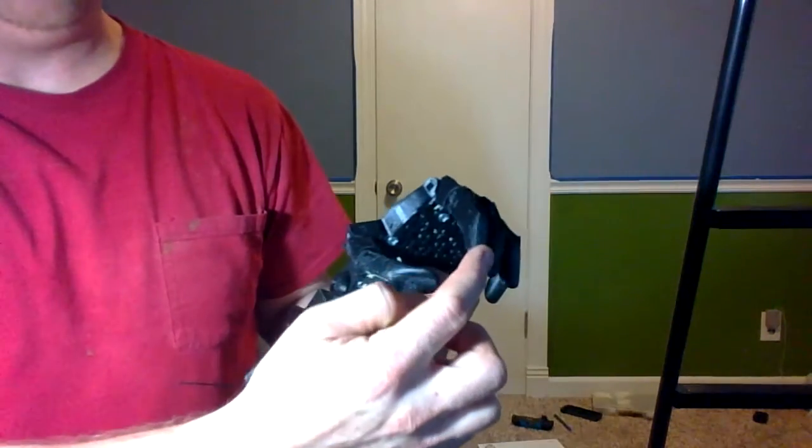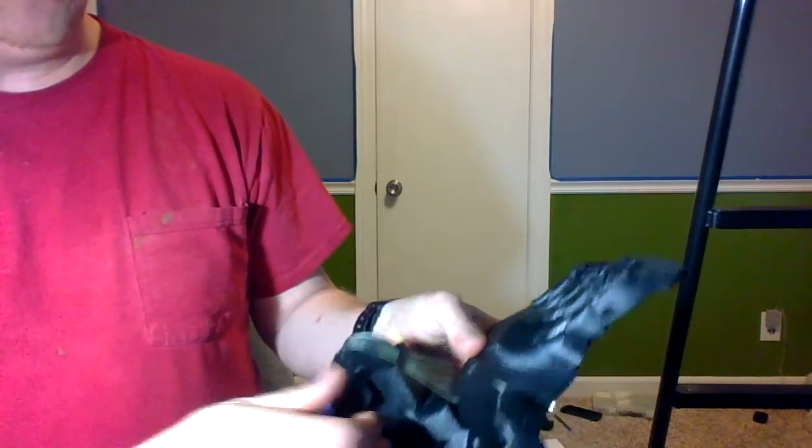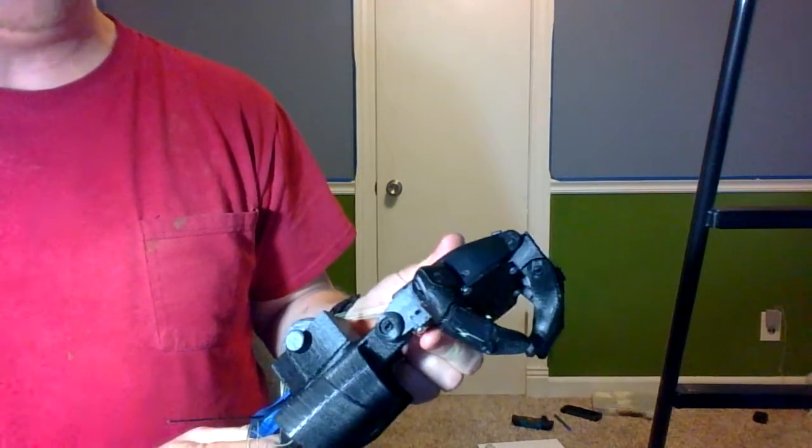This one isn't quite perfectly adjusted yet — again, this is just concept-based. And then I go back to the full grip gesture.